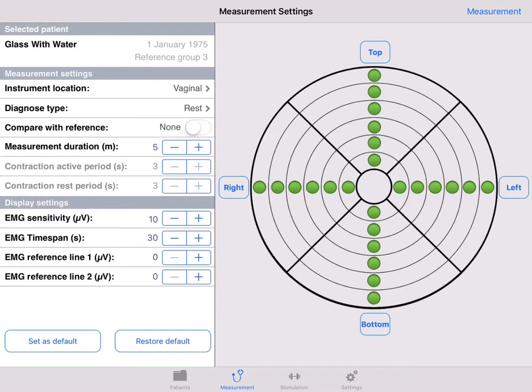Chapter 5: Measurement. We are now ready to start a rest measurement with no comparison to the reference group. To show you the principle, we use our dummy patient glass with water.